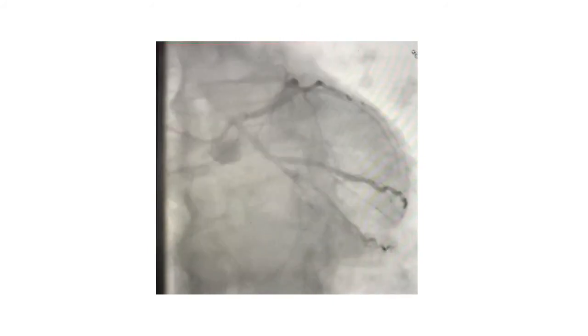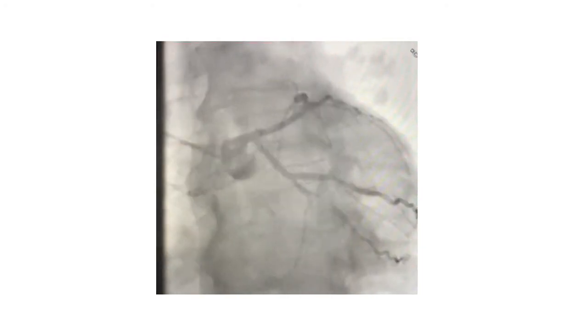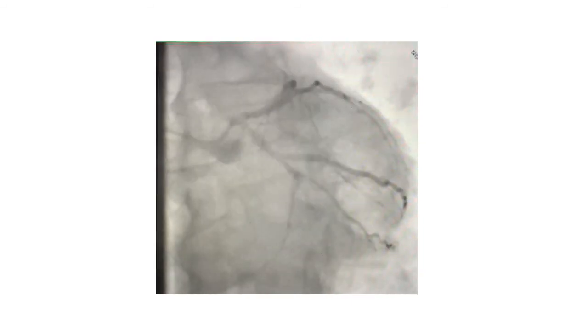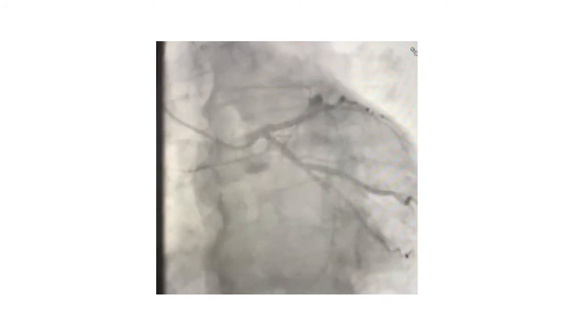Now, in this view, you really do not see the diaphragm that much, if at all. Also, if you compare the position of the catheter and the vertebral bodies behind them, they are really centered. So this is a PA projection. This is flat. But in this case, this is a caudal view.